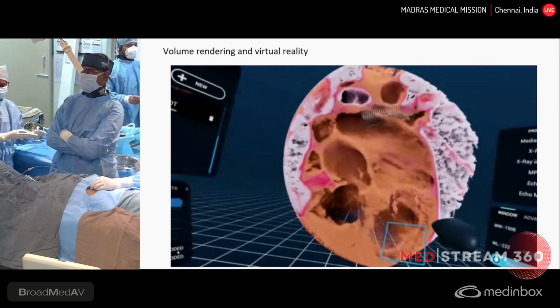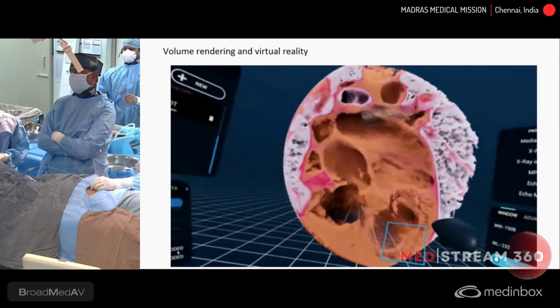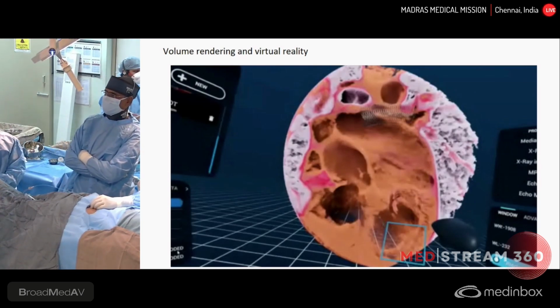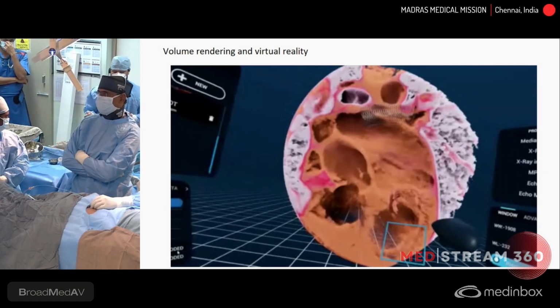So as you had specified the strategy here, we have to set right the left pulmonary artery narrowing so that we have a good amount of blood flow to the left lung, and then we have to put in a competent valve on the right ventricular outflow tract.